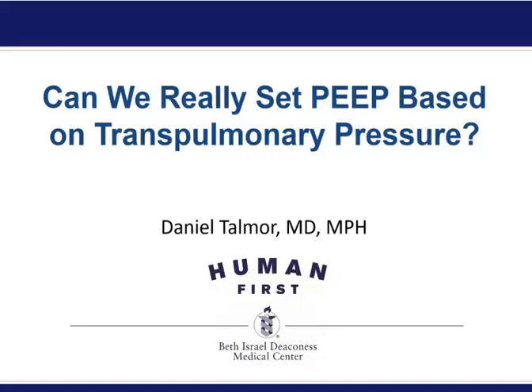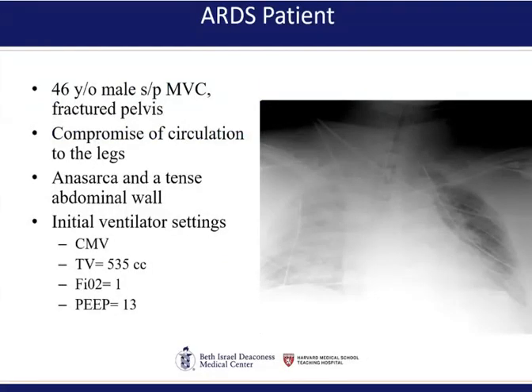So after Lorenzo and Laurent teed me up, I'm going to talk about how we can actually use this at the bedside to set PEEP. So I start with a patient.